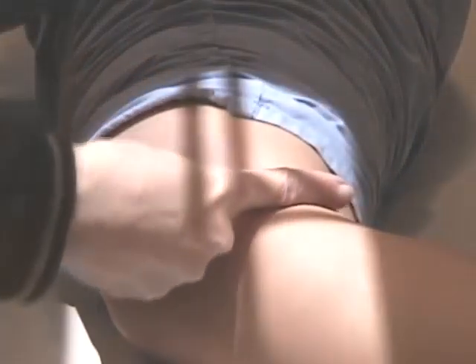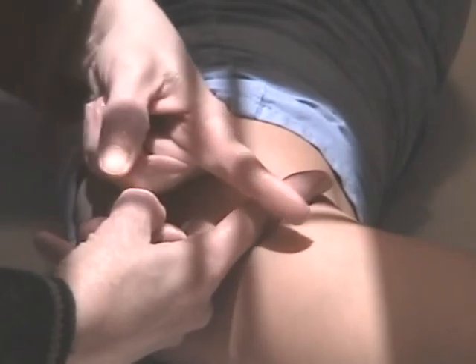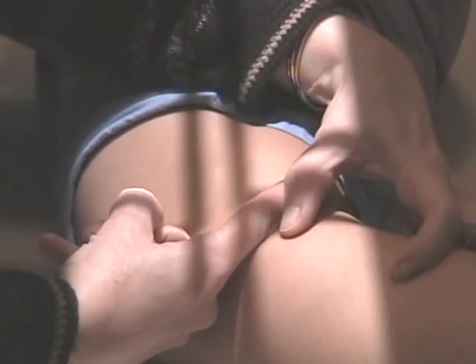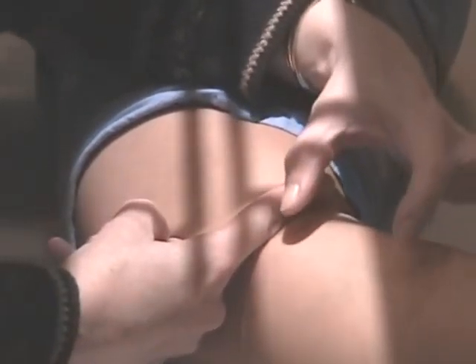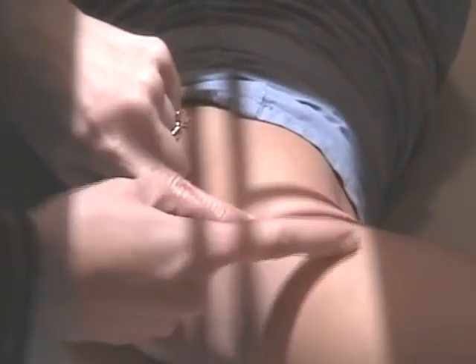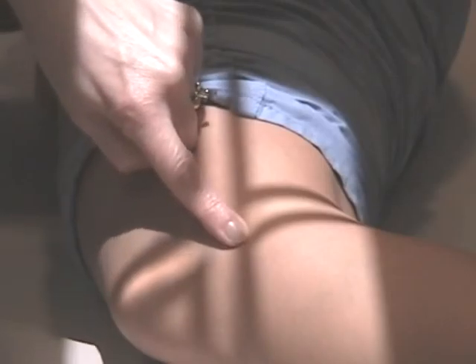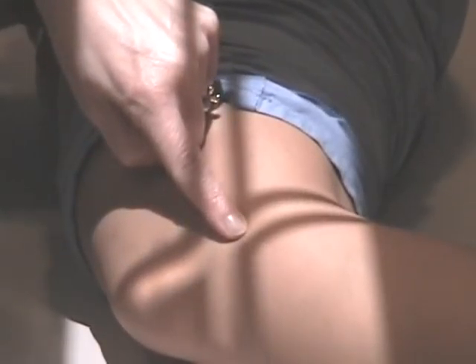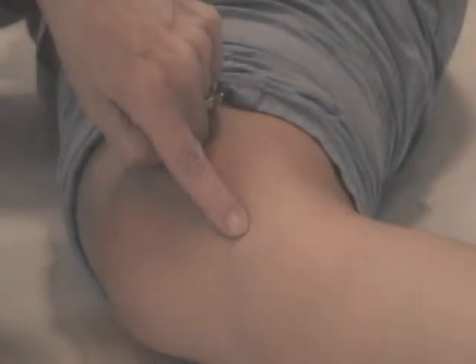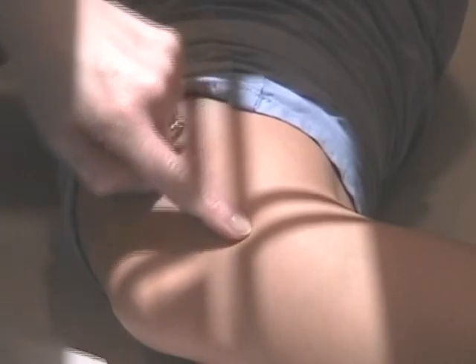Now when I make my T, I'm going to start with where it bends at the knee, and I'm making my T in relationship to the lower leg. See my T? Again, you're going to make a T, but it's with the lower leg. And then where the T comes together, right here, that's the level of the knee joint. With the tube angle, we enter just a little below, because we're angling cephalic now. We enter just a little inferior to the joint space region, maintaining the femur to the center of that crosshair.